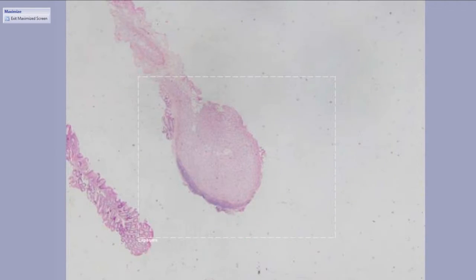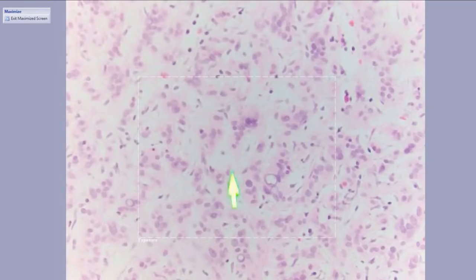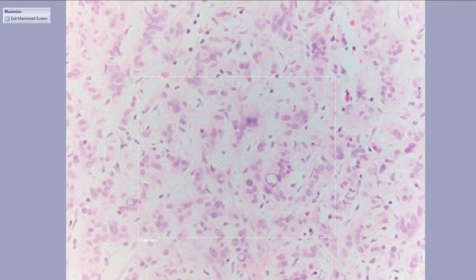Yet another little colon polyp. This is probably some sort of cousin to the Schwann cell hamartoma. Looks kind of similar, but the cells are more epithelioid, kind of more nicely packeted. If you look around, there's actually these kind of cleared out nuclear pseudo-inclusions prominent in the lesion.